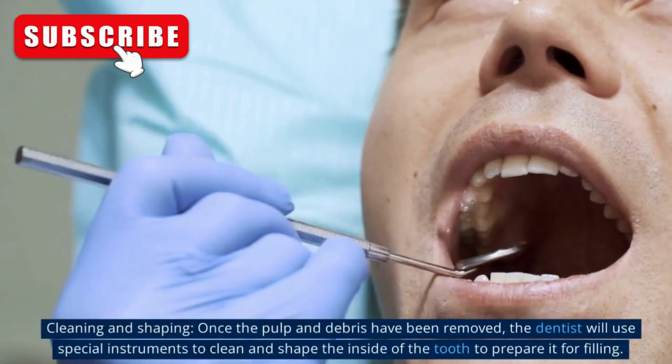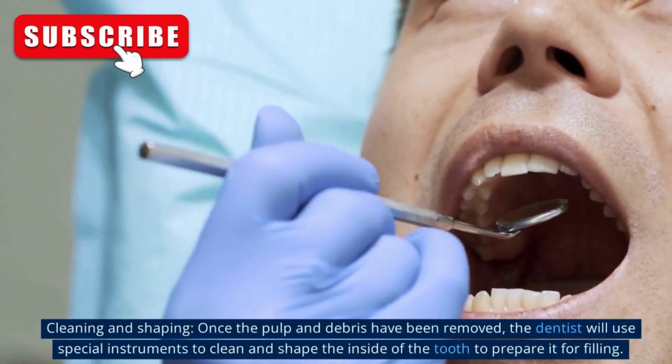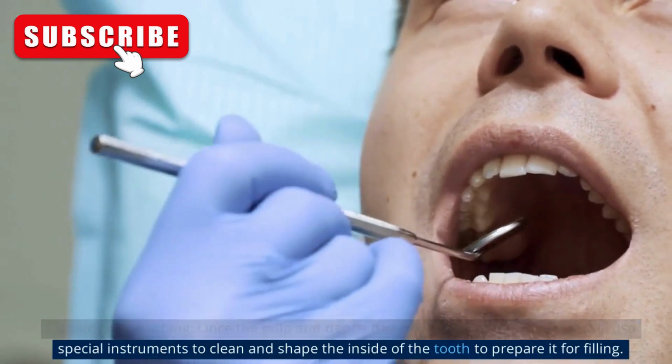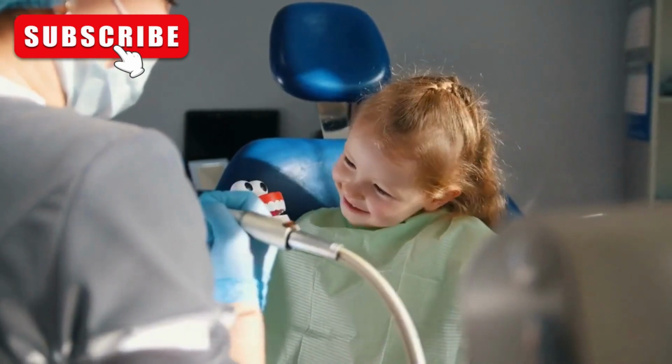Cleaning and shaping. Once the pulp and debris have been removed, the dentist will use special instruments to clean and shape the inside of the tooth to prepare it for filling. This step is crucial to prevent reinfection.